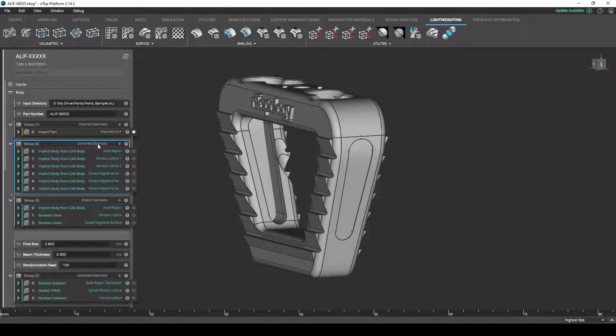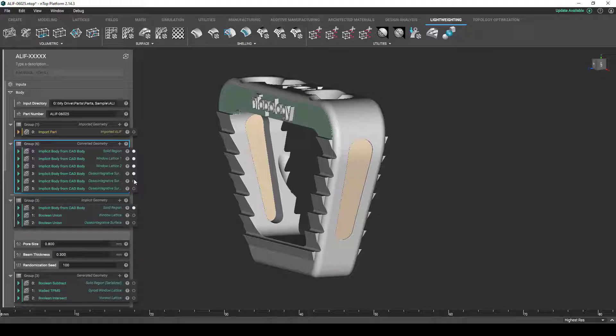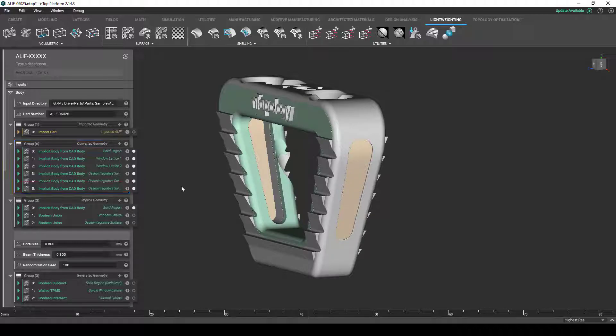But stepping through the process, we can see that we have a CAD body here. And the first step is to convert the CAD body to our implicit bodies. So, if I hide this and I show the individual implicit bodies, you can see that visually, there's really not much of a difference. But now that they are implicit, we can do boolean operations to combine all the similar regions and really separate all these bodies out by a solid region, a window lattice region, and an osseo-integrative lattice region.